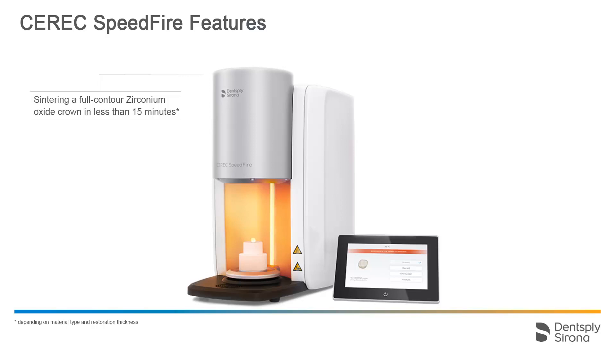A full contour zirconium oxide crown can be sintered in less than 15 minutes. When using the preheating function, a glass ceramics crown can be glazed in 4 minutes and 30 seconds.